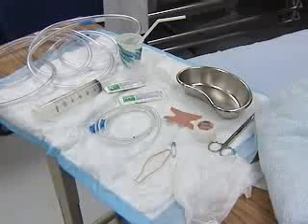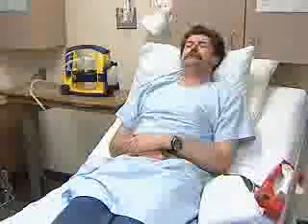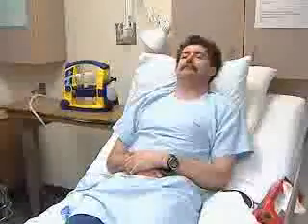Also ready: a glass of water with a drinking straw, and within easy reach of the patient, a towel, tissues, and the emesis basin.